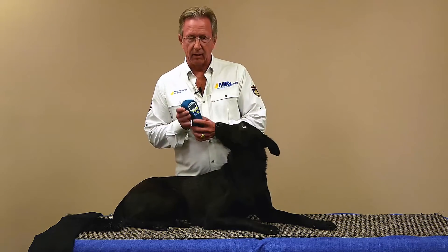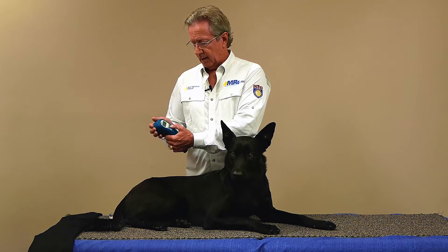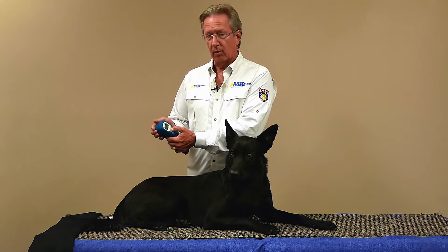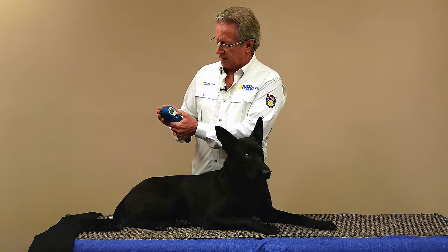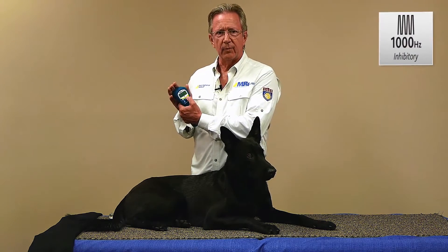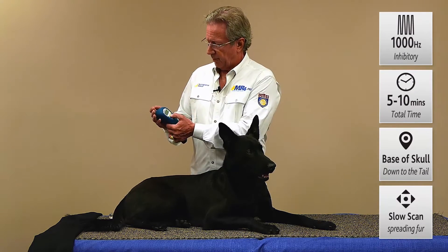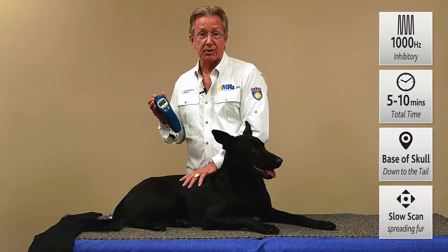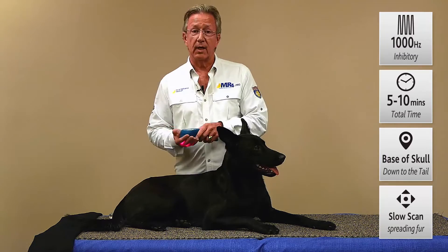So the unwind protocol today, utilizing our ActiBet Pro — we'll fire this up. It asks if we want to do a self-test; we'll say no. ActiBet Pro mode is the one we want to use. We're going to select 50 hertz, then take it up to 1000 hertz, which is our go-to for pain and what we use in the unwind protocol to relax them. We'll press select, run it up to five minutes — plenty of time to treat the entire spine — and say go. Now it's in full operation.